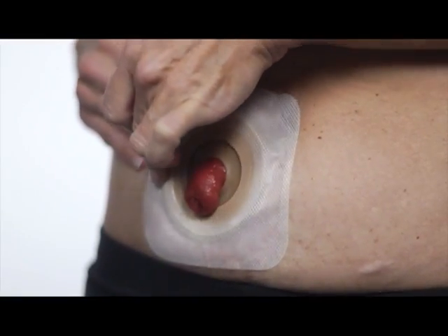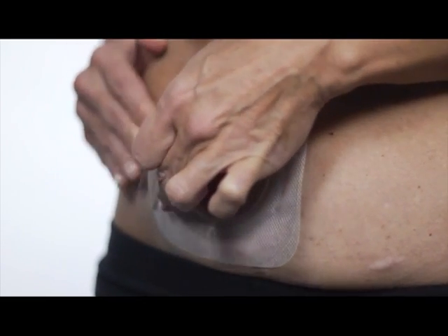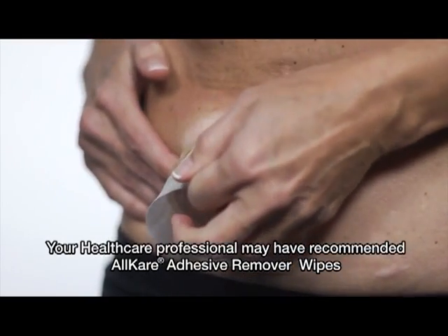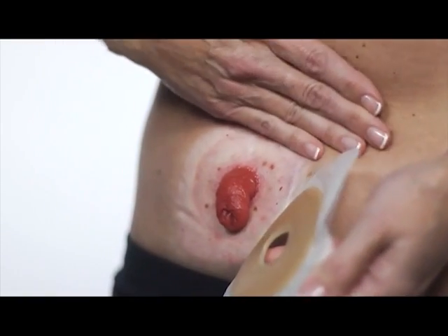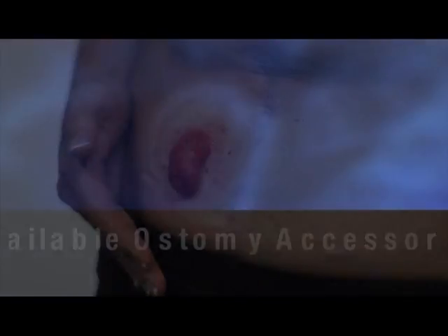To remove your wafer, gently pull the wafer down away from your skin while supporting the skin with your other hand. Wipes can be used to aid in removal of the pouch and any adhesive residue left behind. Clean your skin and mold or cut and apply a new wafer. Make sure to wash your hands when finished.